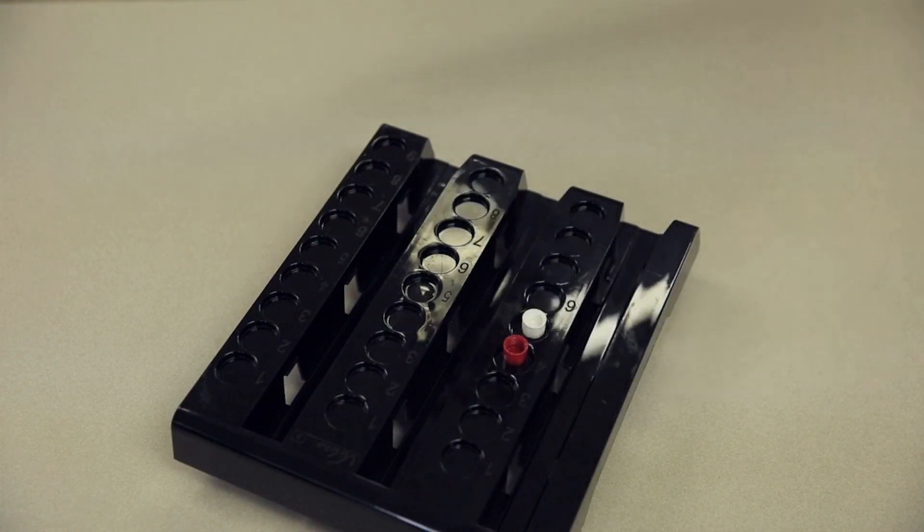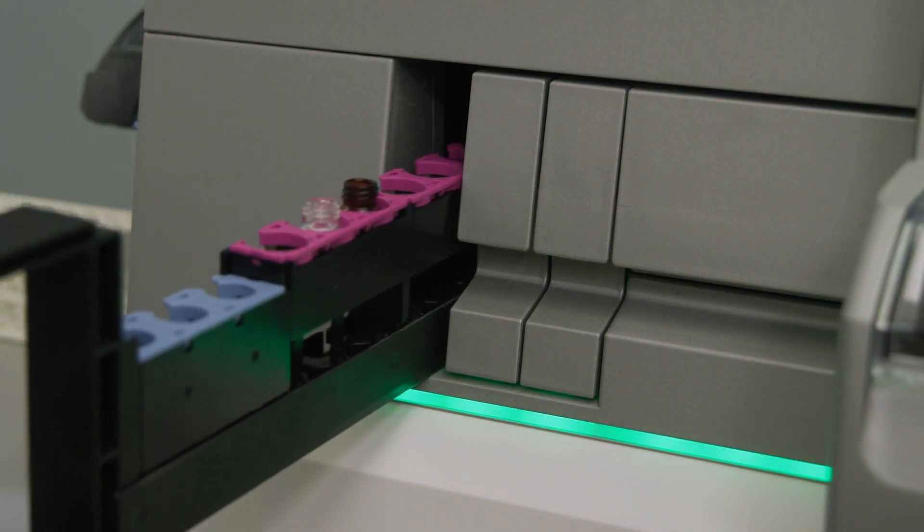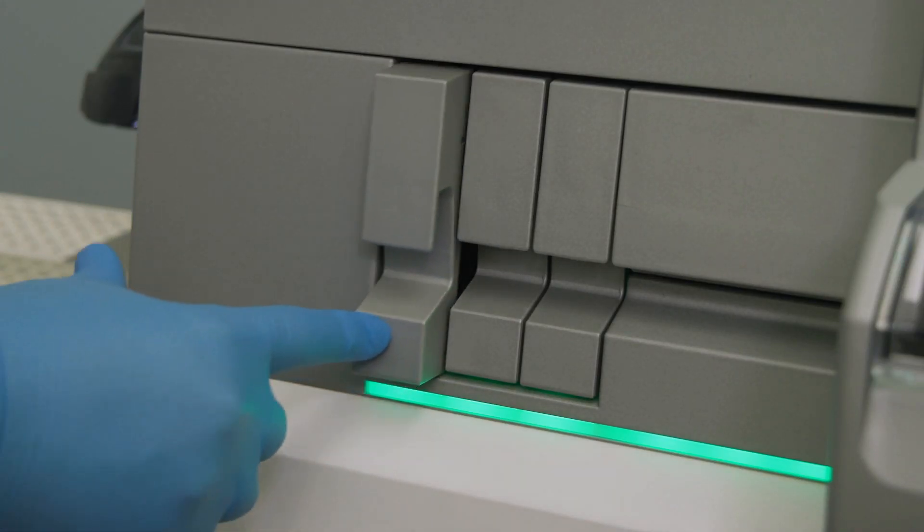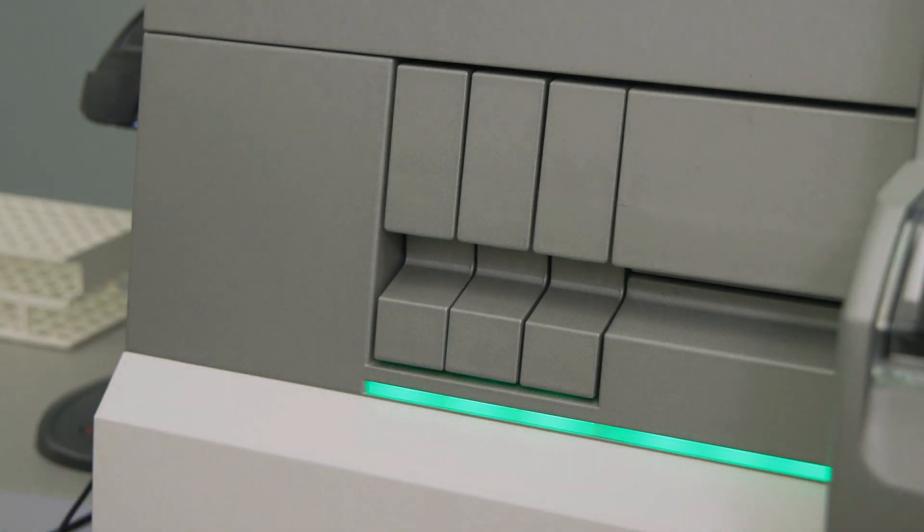Slide the rack out of the rack holder tray and insert it into the instrument loading bay. The barcodes on the rack segments and vials are read as the rack is pushed into the loading bay. Ensure that the rack securely clicks into place.